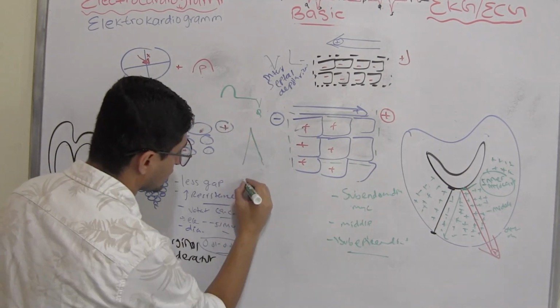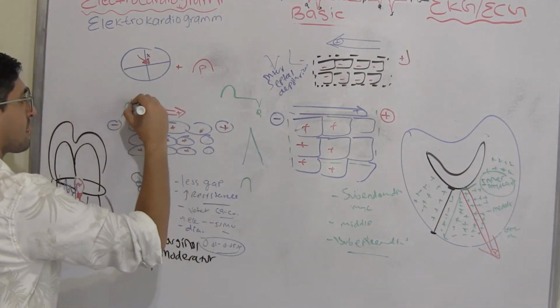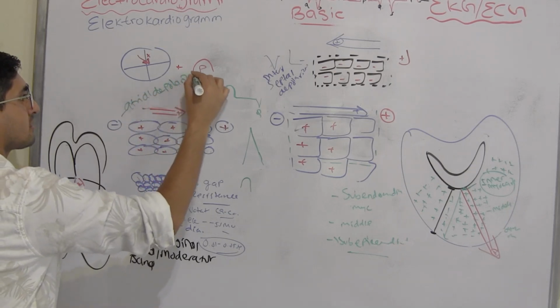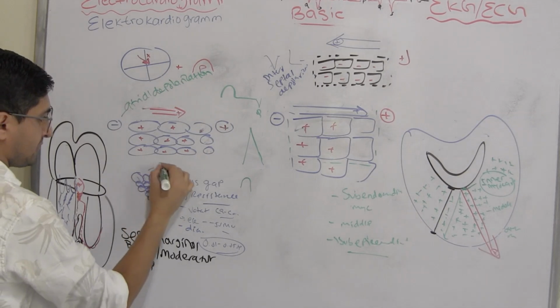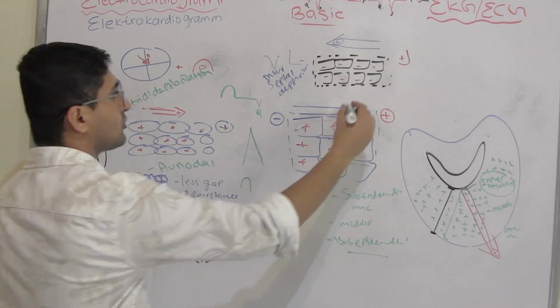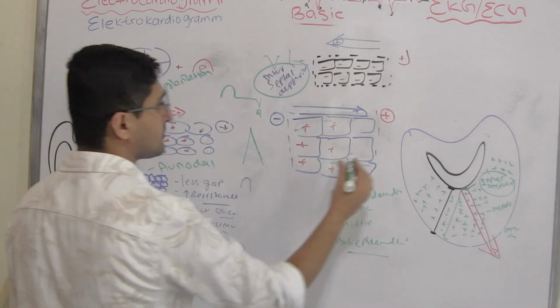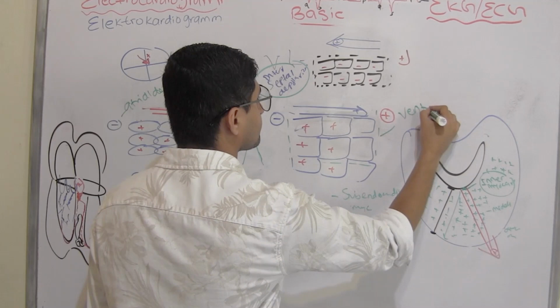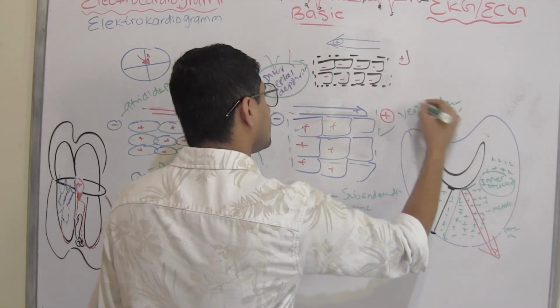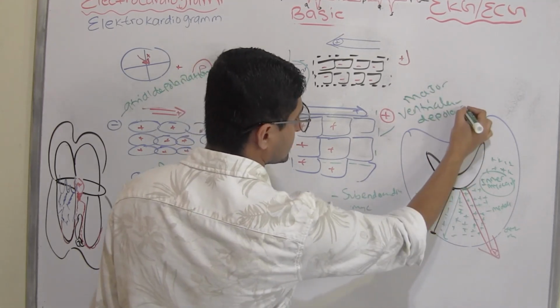So you have, obviously we talked about P. Remember, this is atrial, right? This one is my atrial depolarizations, right? This is my AV node. Current is passing through the AV node, right? This is going to be my interventricular septal depolarization, and this is going to be my ventricular depolarization. It's the major ventricular depolarization. Major, right? Depolarizations.